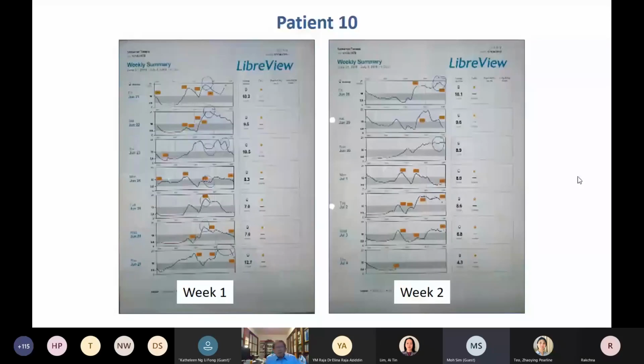For this particular patient, you can see that for both weeks, there are very high glucose levels, and these are all above the shaded lines. You can also see days where the glucose levels are below the shaded line. So this patient was having hyperglycemic episodes as well as hypoglycemic episodes, and this was again reflected in the HbA1c. What we did for this patient is that we reduced his night insulin and increased his morning insulin, and told him to moderate his meals, particularly his lunch meals, which were way over the targets.